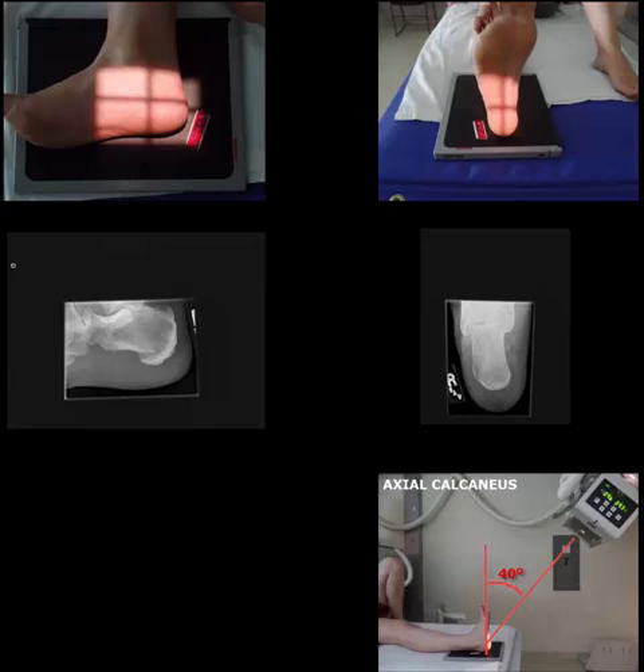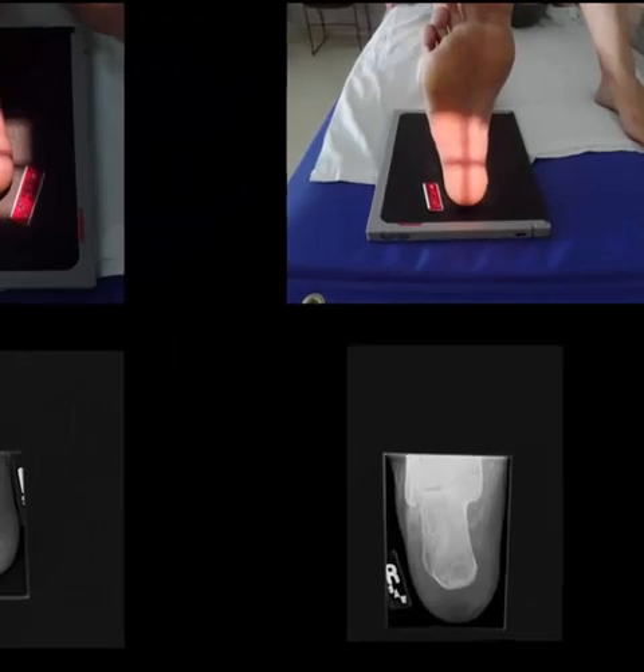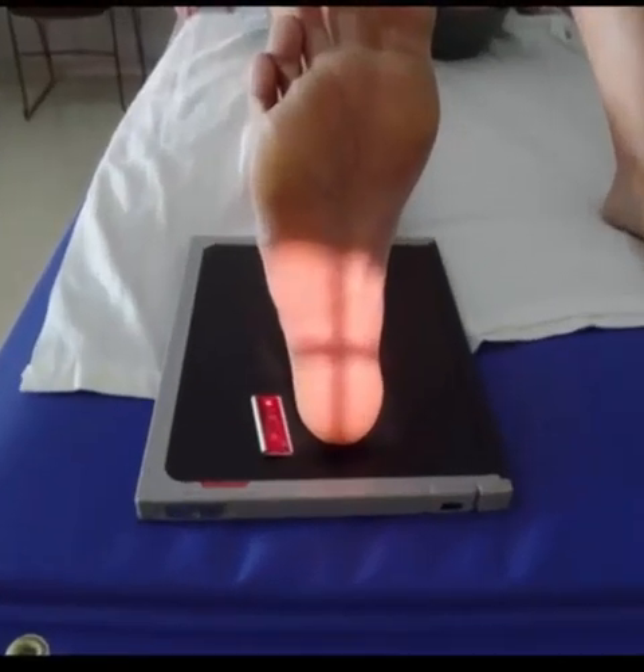When performing a routine calcaneus series, there are two common projections: the axial and the lateral. Once you've instructed the patient to remove their sock and shoe, have them lay supine on the radiographic table. You'll want to center the heel of the foot on the lower third of the image receptor.